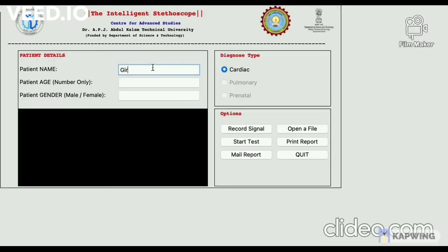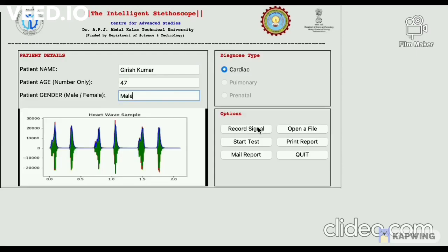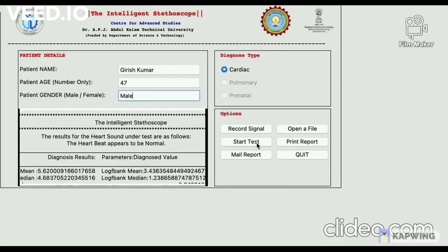In the test demo, entering patient name, patient age, and patient gender. Click on record signal — the signal has been recorded. Click on start test — the heartbeat appears to be normal.